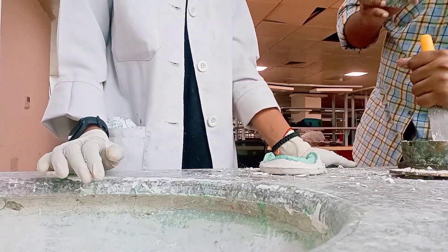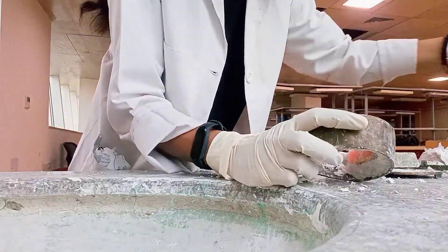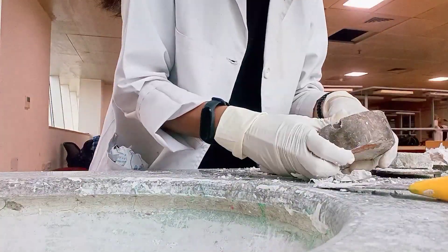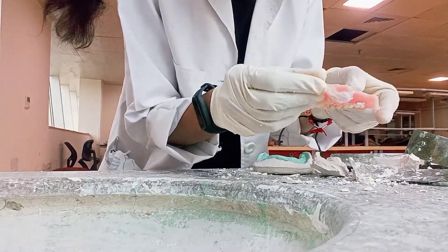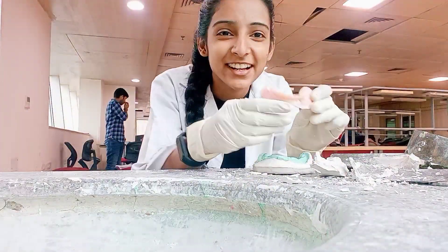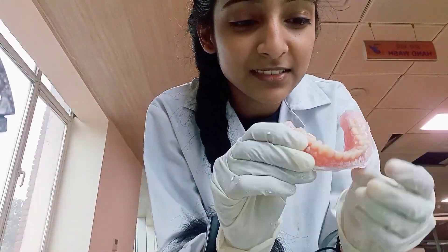So let's see how my denture comes out. After doing a lot of hard work, when you have your hand-made denture, you can see my happiness. So my first mandibular denture is here and I have to trim it. Then I will show you after finishing and polishing.